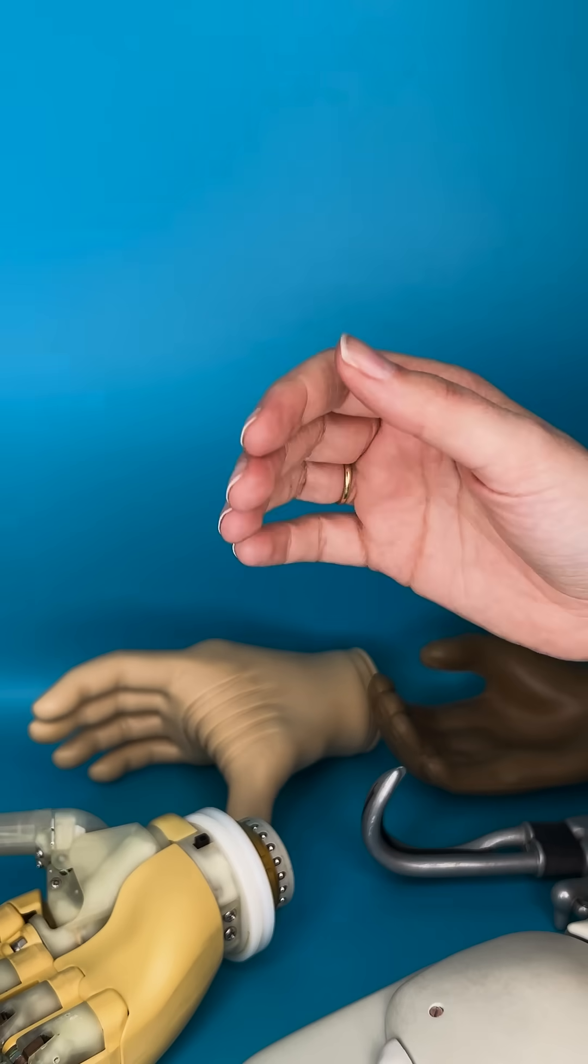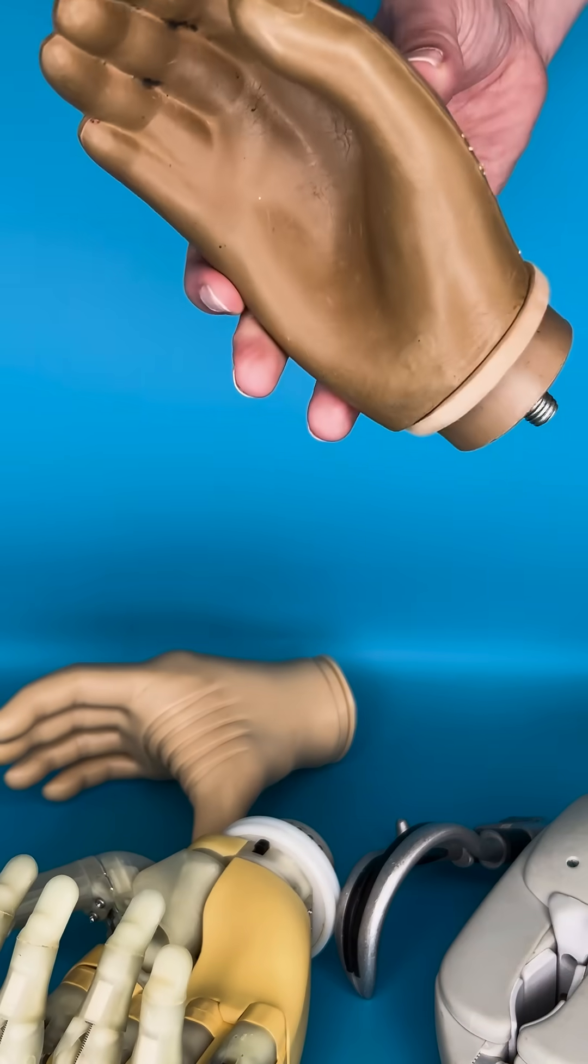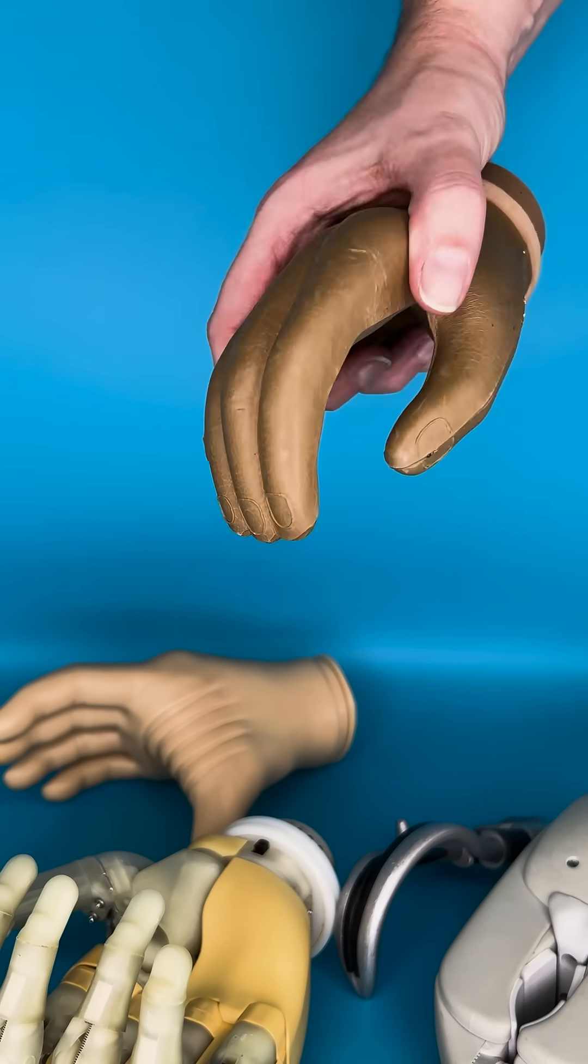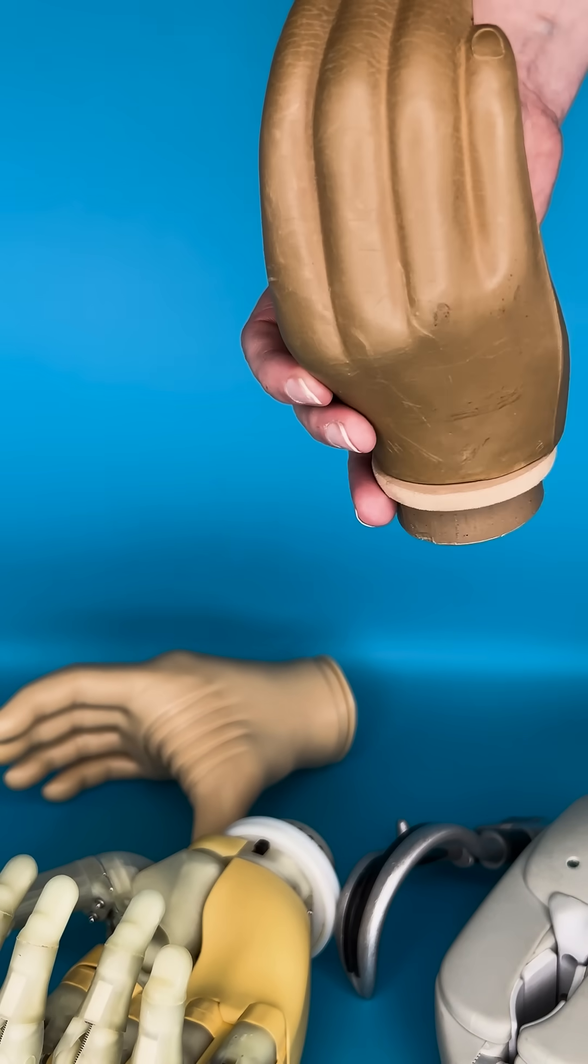There are different options but there's usually a trade-off between function and appearance. This is a passive hand, it doesn't move. You might choose something like this if you wanted a lifelike solution. They can be used to stabilize objects and they're nice and light.